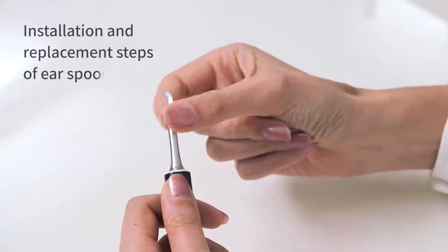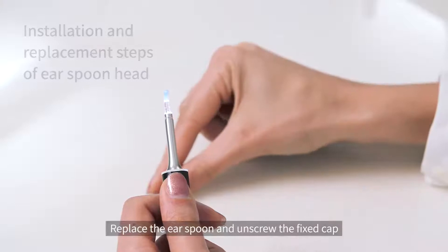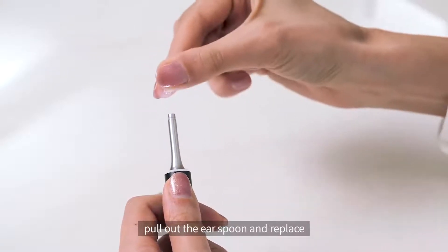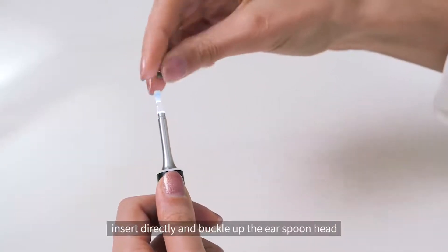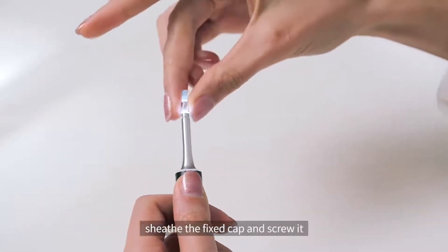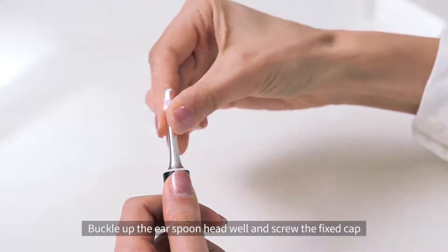Installation and replacement steps of the ear spoon head: unscrew the fixed cap and pull out the ear spoon to replace it. Insert the new ear spoon directly and buckle up the ear spoon head. Then sheath the fixed cap and screw it tight.